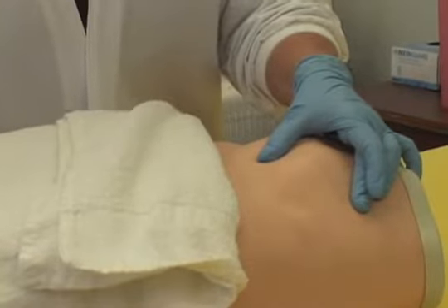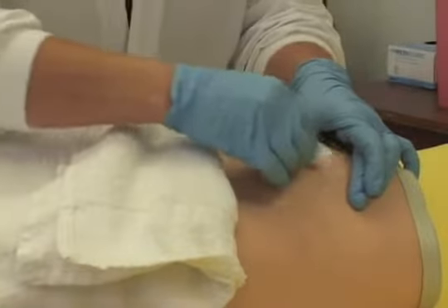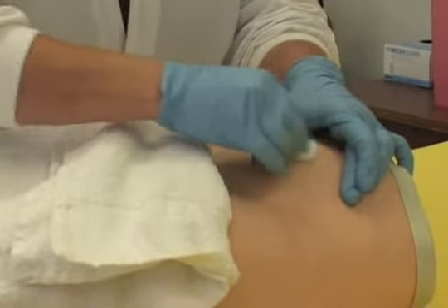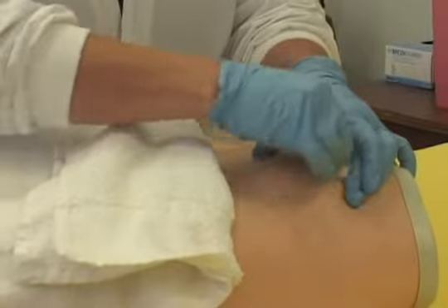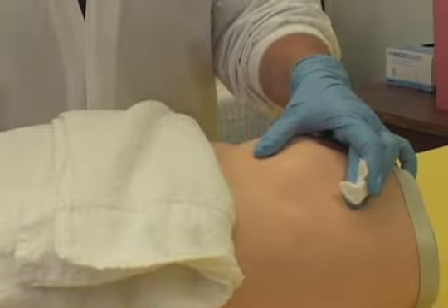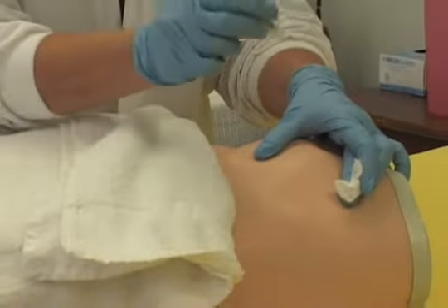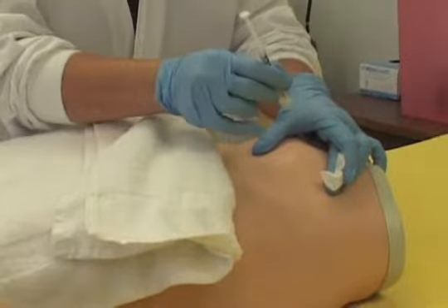Cleanse the intended injection site thoroughly with alcohol wipe. Use a gauze pad in the lab, moving in a bullseye motion and working outward. Remove needle cap or sheath without contaminating needle. Do not allow the cap to fall into and remain in the client's bed.